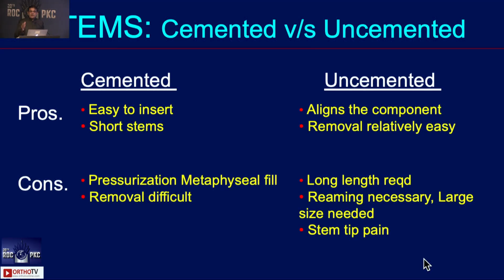What stems and when to use them. Now the main topic is whether to use cemented or uncemented, and here is the slide. If you understand this slide, you've got the differences. So this is the very important slide. Let us look at the pros of using a cemented stem.